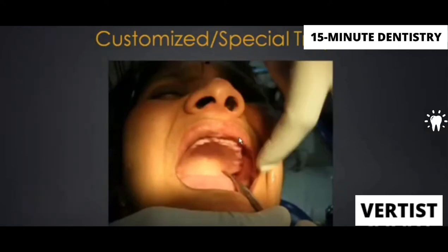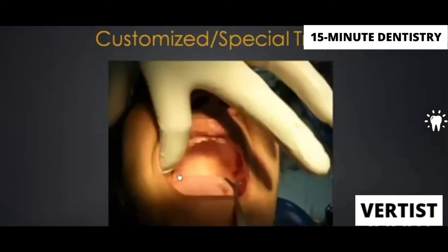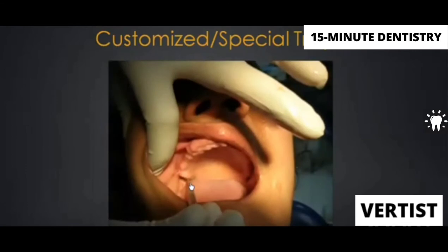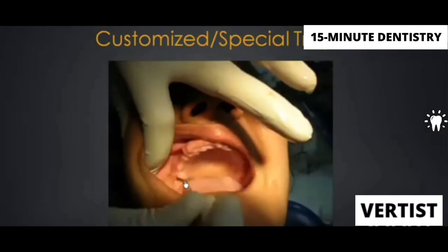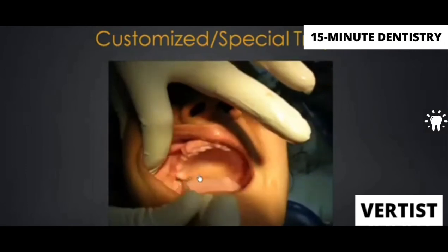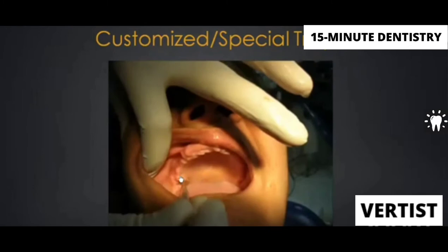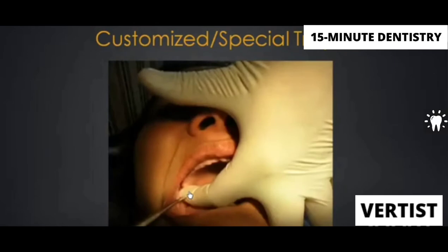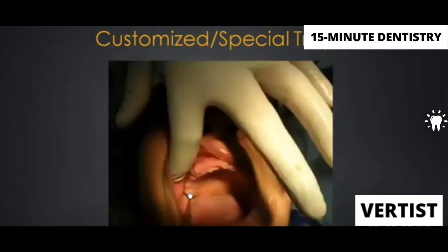For that, you have to know where the posterior vibrating line is. So I hope all of you know about this particular instrument. This is a T burnisher. It has a round end and a flat end. Keep the round end towards the palate, keep it on the ridge, and then just go posteriorly till it falls in the hamular notch. I'll not tell you where the posterior vibrating line is.